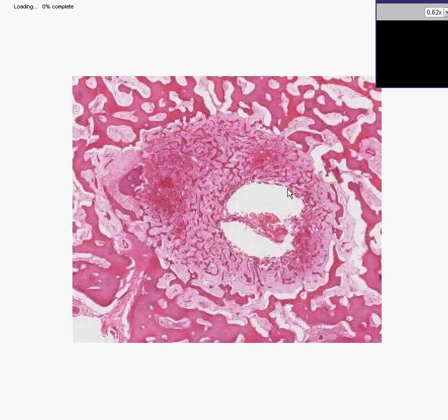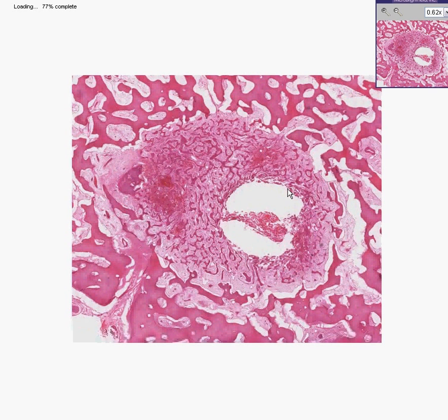This tumor is called an osteoid osteoma. It is a tumor of generally teenagers and young adults. It occurs more likely in the lower extremities. It's a benign tumor. If it was not a benign tumor, it wouldn't have the name osteoma — it would be an osteosarcoma.